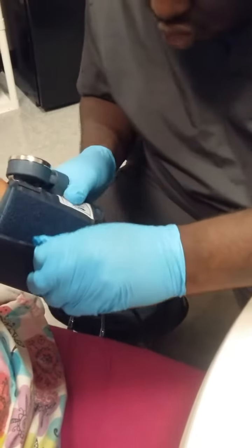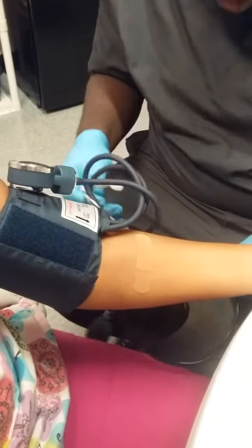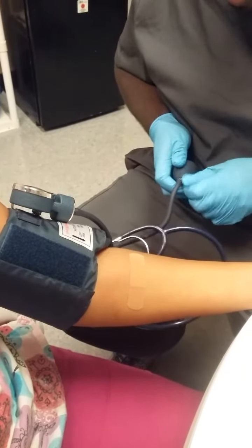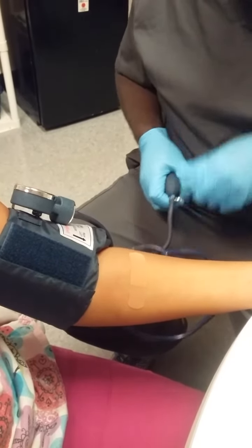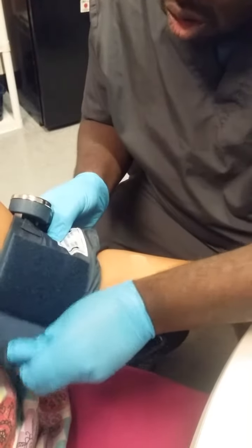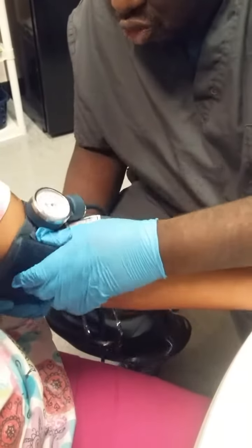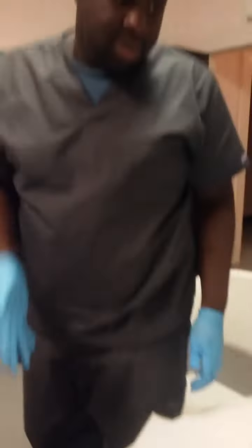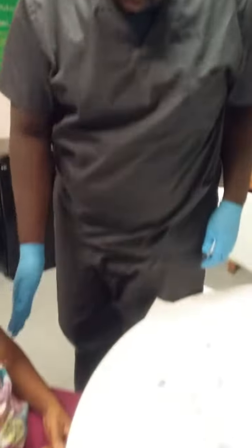We release the air from the blood pressure cuff. We remove the blood pressure cuff. And after we remove the blood pressure cuff, we've applied the bandage.